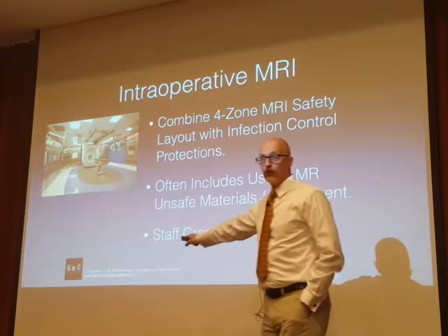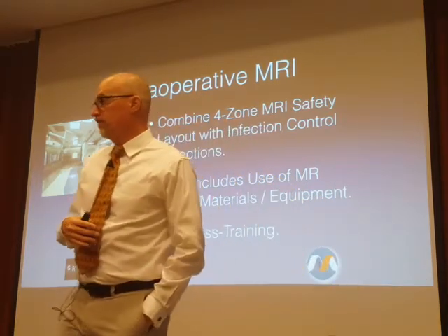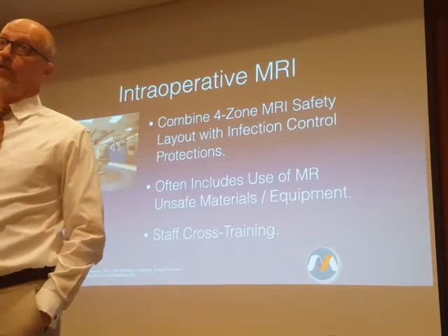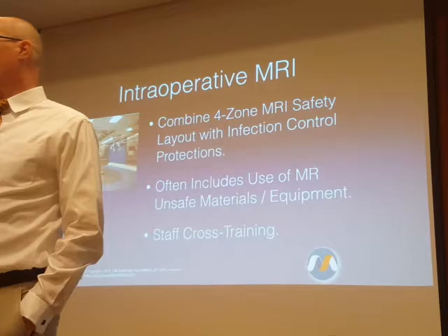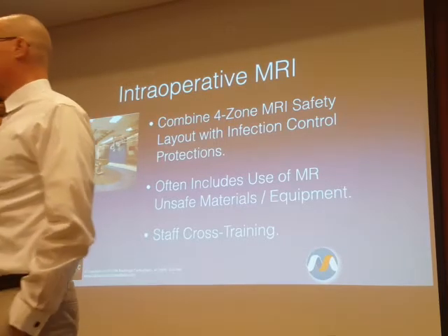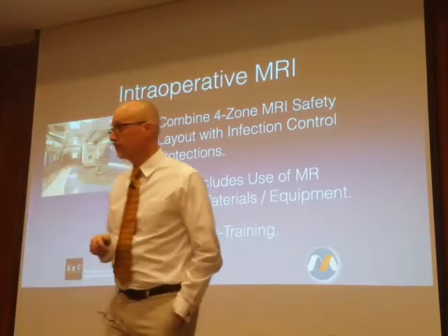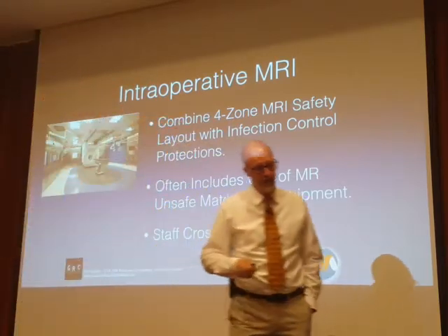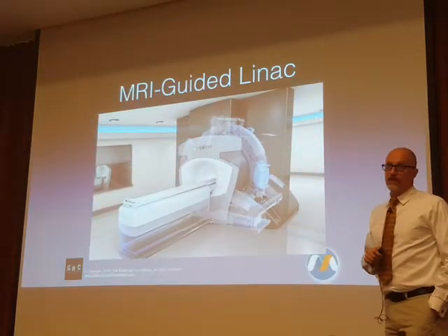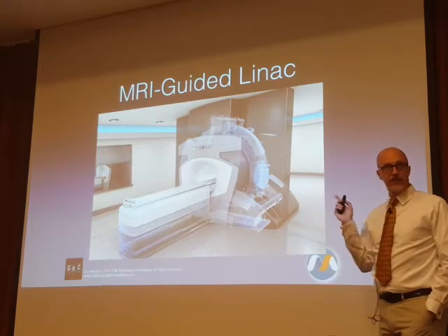Similarly, now we have cross-training issues because we have surgical staff who may not really have any meaningful prior exposure to MRI safety, and we have to impress upon them the importance of integrating safe practices concurrent with their existing surgical practices. Perhaps the newest of these new devices is MRI LINACs, linear accelerators.